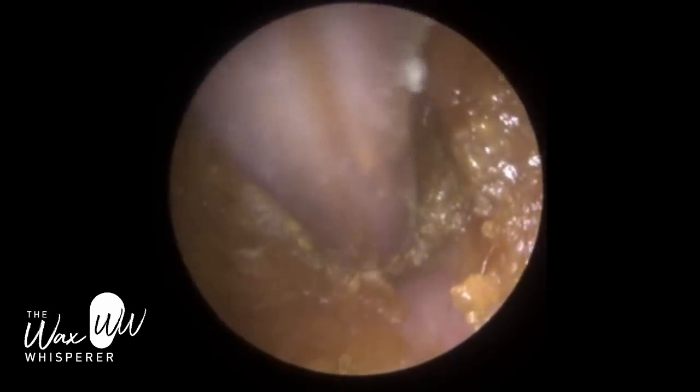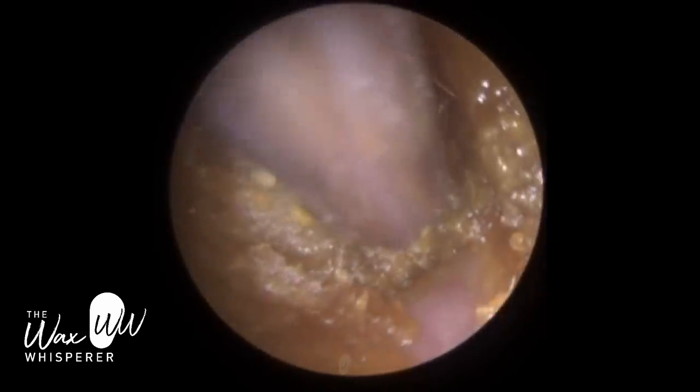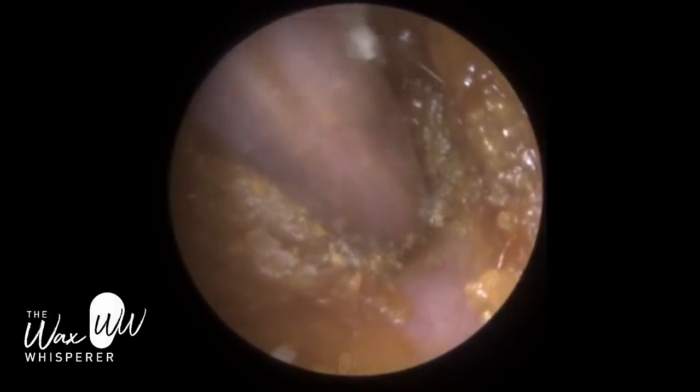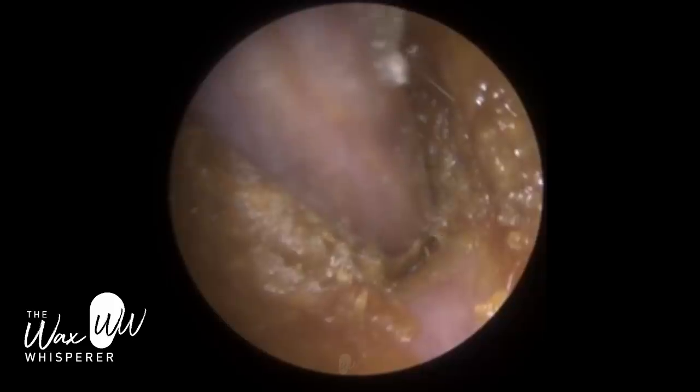This is the patient's left ear. You can see the wax is quite soft and it was really deeply impacted, so I did ask the patient whether they had used a cotton bud. The patient did admit that they were getting a bit of itchiness, so they did poke in their ears. You can see there's a bit of surface wax on the ear canal wall.